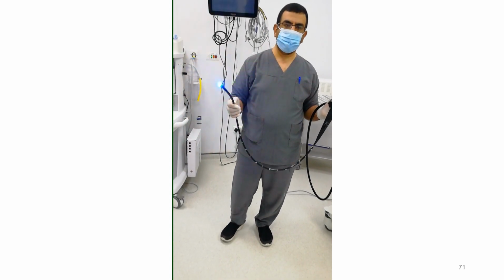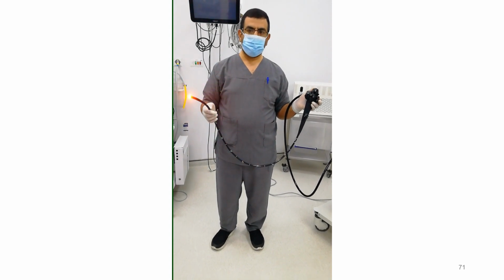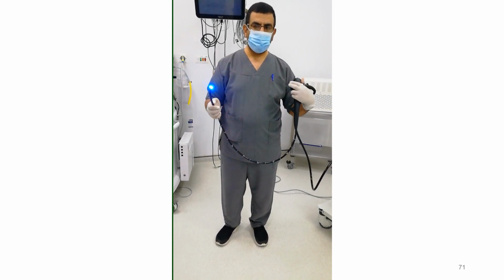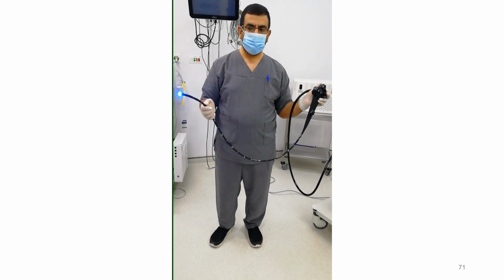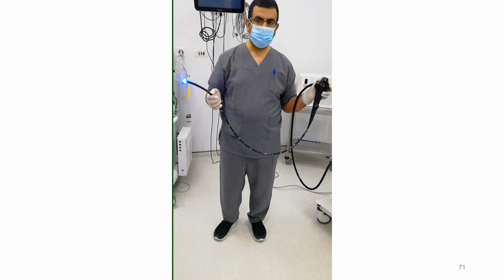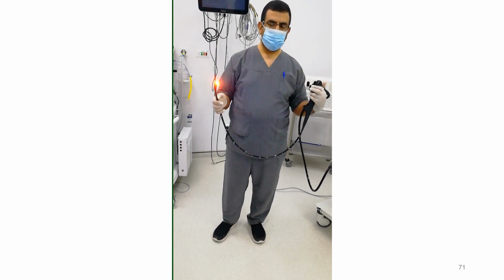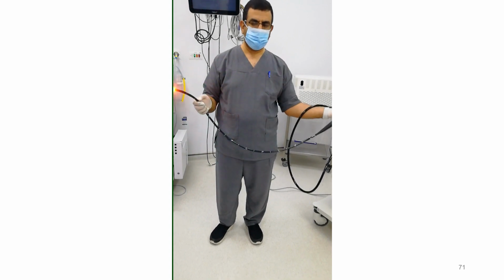في تالت حركة بتتنقل من المنظار عن طريق الشافت وعن طريق الإيد الشمال. بص كده الإيد الشمال. شايف؟ المنظار لوحده بيروح يمين وشمال، خلاص؟ يبقى دي من الحاجات المهمة قوي إن أنا ممكن أعمل منظار كده وكده، يبقى أنا بستخدم الشافت بس فبطول العمر الافتراضي عندي للمنظار، وده اللي أنا شخصيا بستخدمه. برضو ممكن تعمل بإيديك كده خلاص، أو ممكن تعمل بإيدك كده.